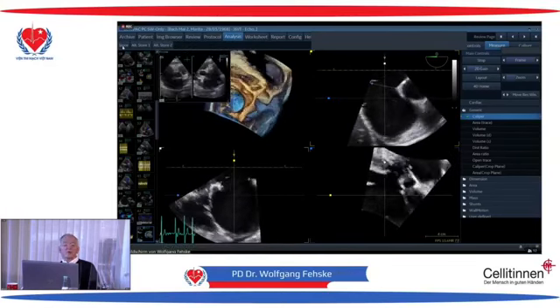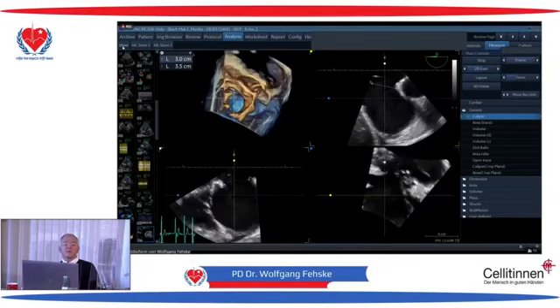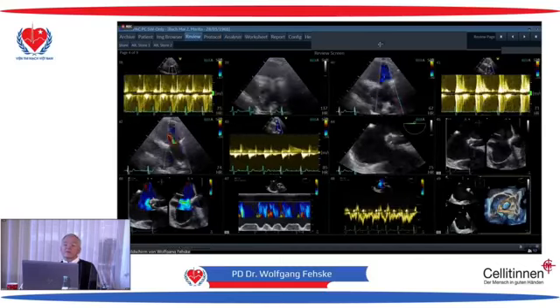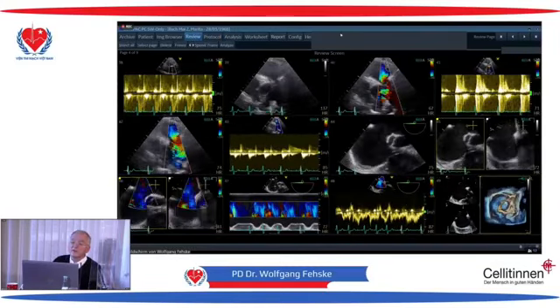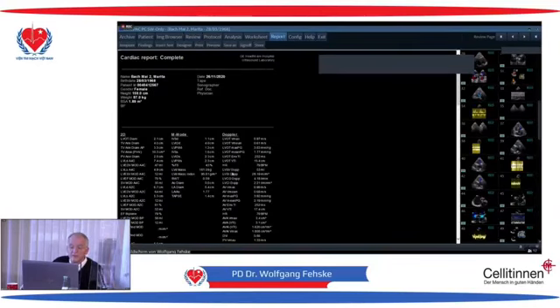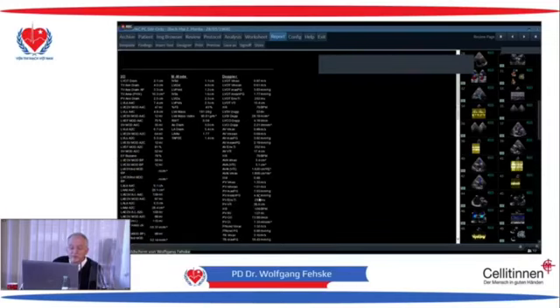And how did we operate on the patient? Did we completely close the ASD? I tell you what we have done. We have first of all calculated the QP over QS. Just a minute. I give you the results: we have cardiac output in the left, it is 53 compared to 127. This makes a shunt which is 2 point something left to right shunt. Is that okay? Can you translate and ask if that is okay?